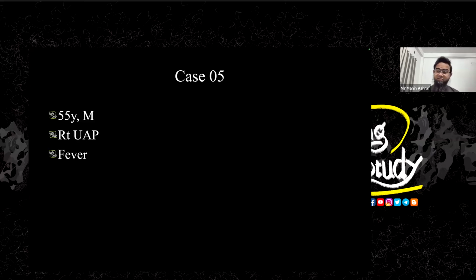So it's a 55-year-old male patient who has a history of right upper abdominal pain and fever. Let's see what we have got on ultrasound.